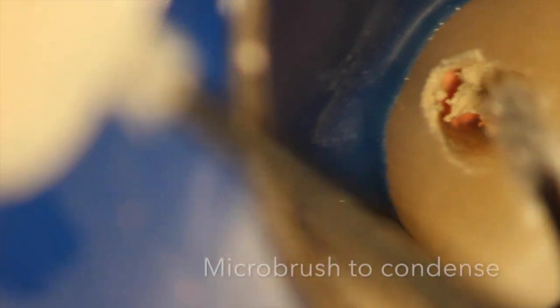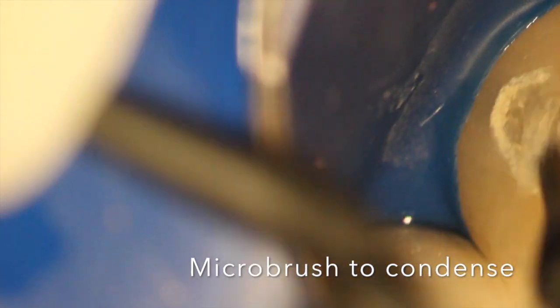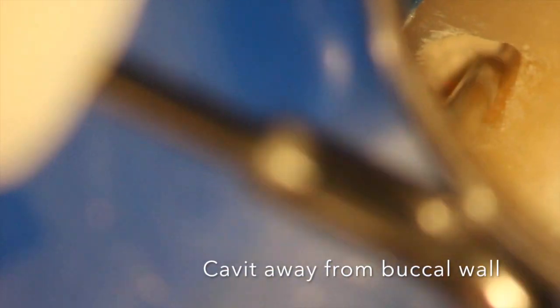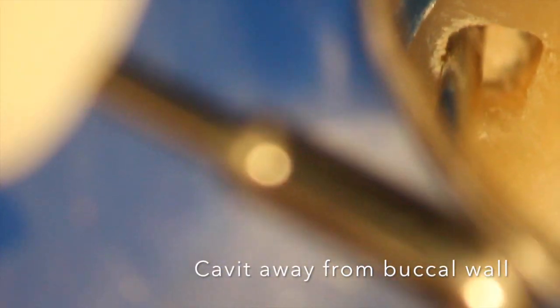We put a little cavit plug over the gutta-percha. It's thought that this cavit plug prevents cervical resorption. I'm not sure how realistic that is with the milder chemicals used today and no more heat, but we still do it as part of protocol. We then wipe the cavit off the walls to let the bleach really soak into the buccal wall.